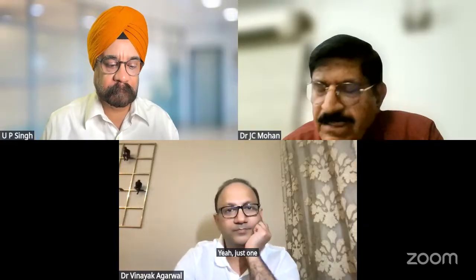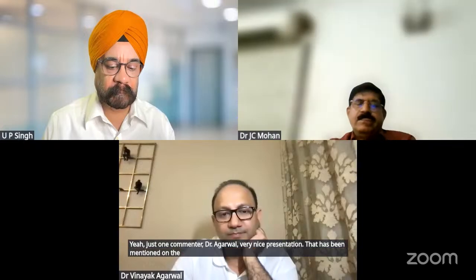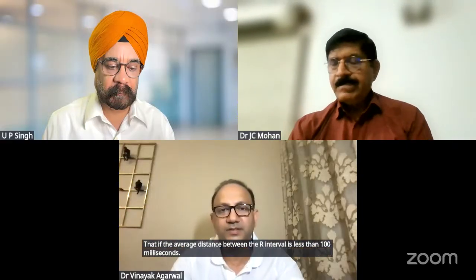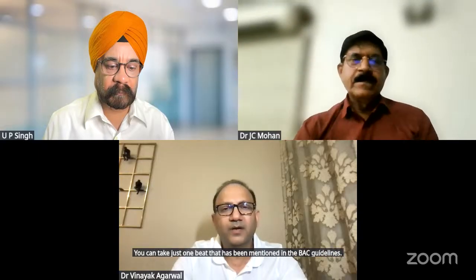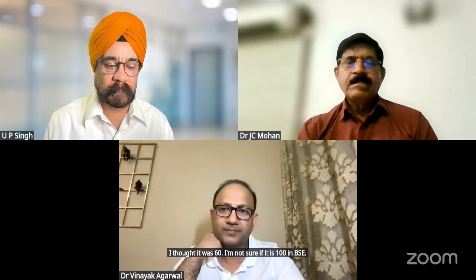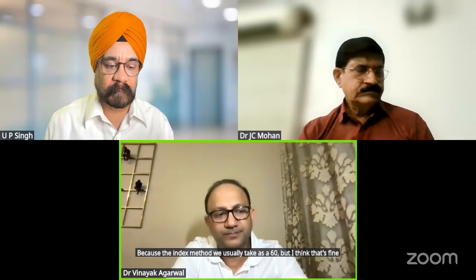Dr. Hamid? Yeah, just one comment, Dr. Agrawal, very nice presentation. On the issue of one beat or multiple beats averaged, it has been mentioned that if the average distance between the RR intervals is less than 100 milliseconds, you can take just one beat. That has been mentioned in the BSE guidelines. I thought it was 60. I'm not sure if it is 100 in BSE. Yeah, I remember it's 100. Maybe we can check it up. Because the index beat method we usually take as 60, but I think that's fine. Fair enough. Sure.